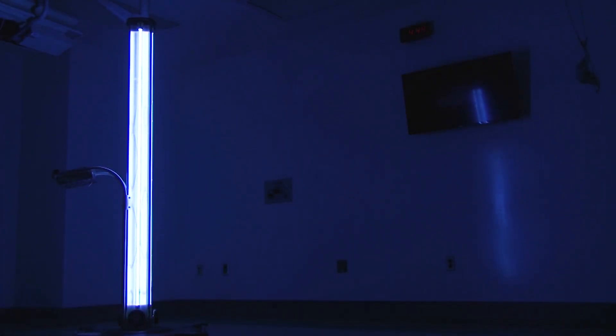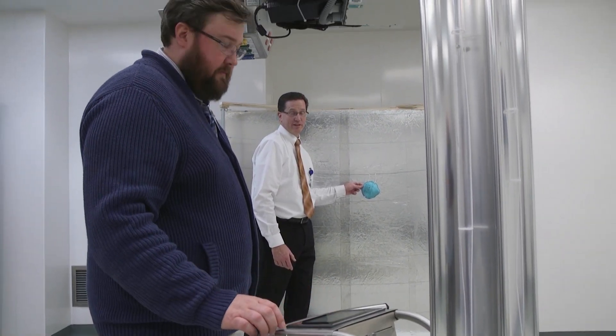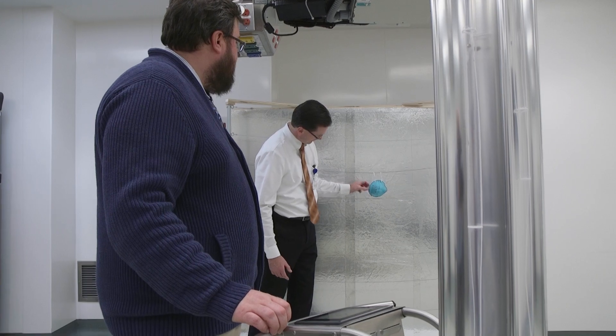Our central processing department will be collecting them from all the sites. Each one will be individualized to the staff member that was using it, disinfected, and sent back to the sites so that specific mask goes back to the person that was wearing it.